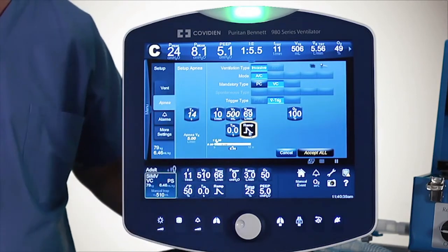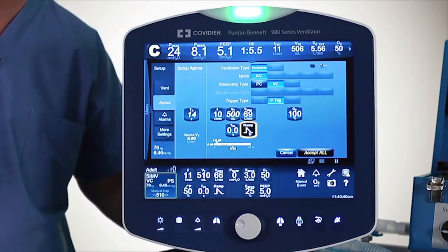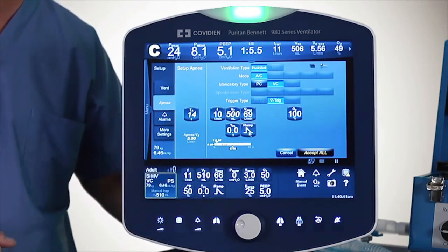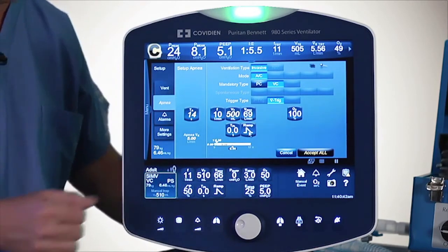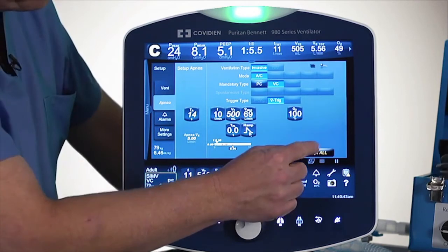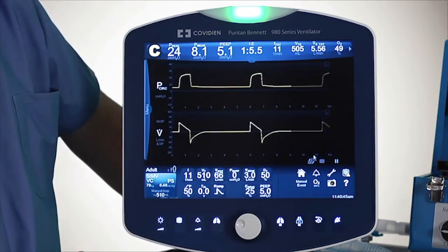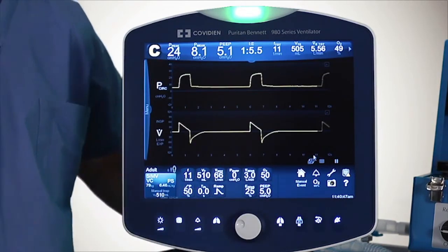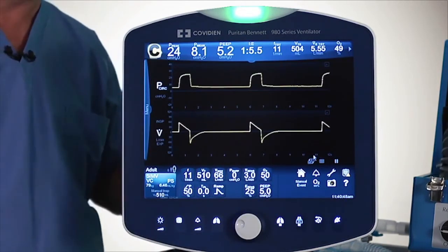The last step, once again, once I have my apnea settings set, is to always push the accept key. And so now I've set my apnea settings.